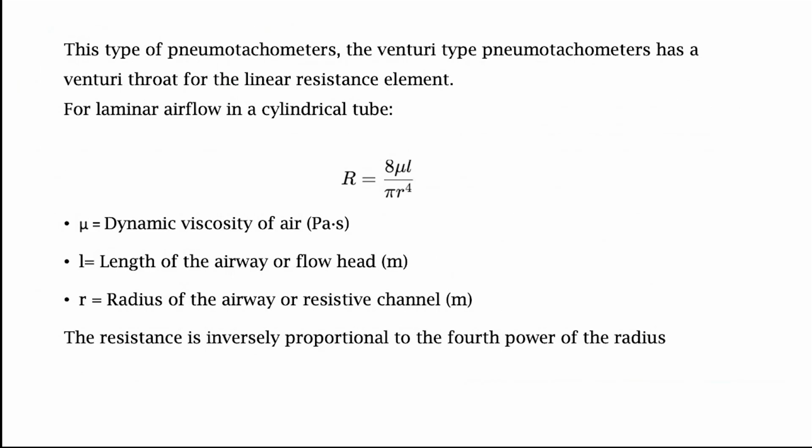You would think that turbulent flow will add noise, but that is not always true. Turbulence changes the pressure and flow relationship in a way where it is no longer linear but rather quadratic. It just means that your equations change. That is the nonlinearity that it brings.